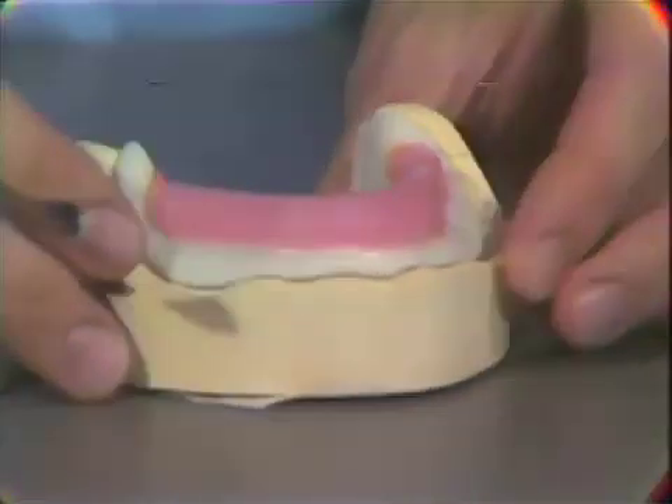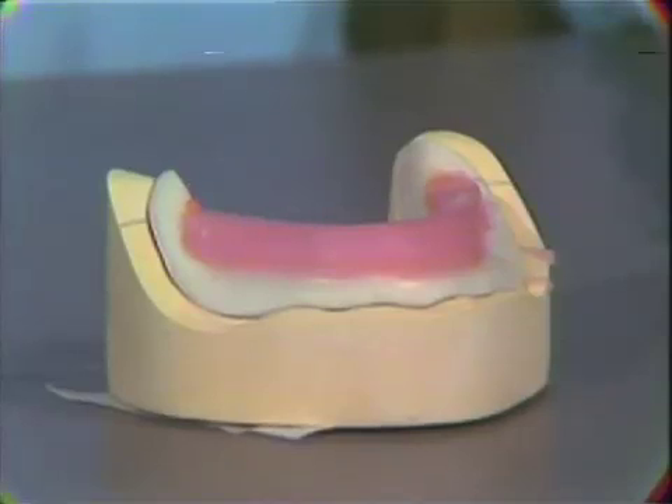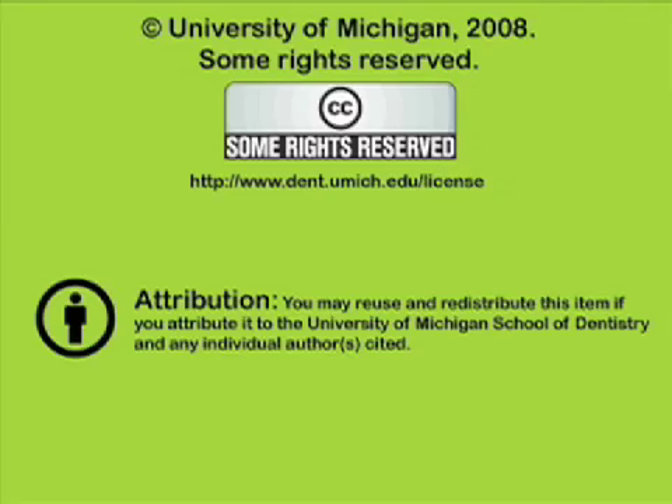This completes the construction of the mandibular base plate. You've been listening to a presentation from the University of Michigan School of Dentistry, which is dedicated to supporting open learning and open educational resources. This recording is licensed under the Creative Commons and may be reused and redistributed for non-profit use. Please attribute materials to the University of Michigan School of Dentistry and redistribute under this same license. For more information visit www.dent.umich.edu/license.